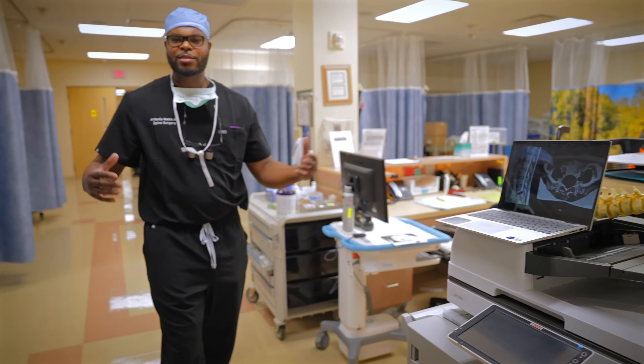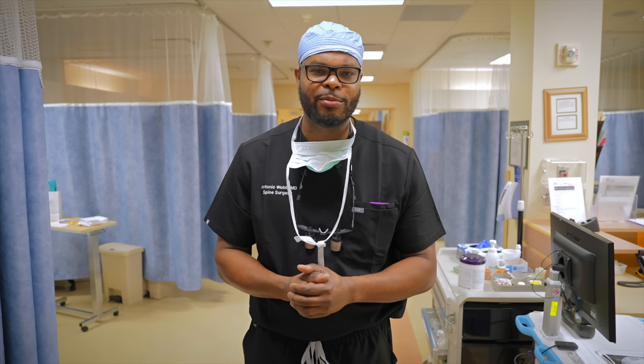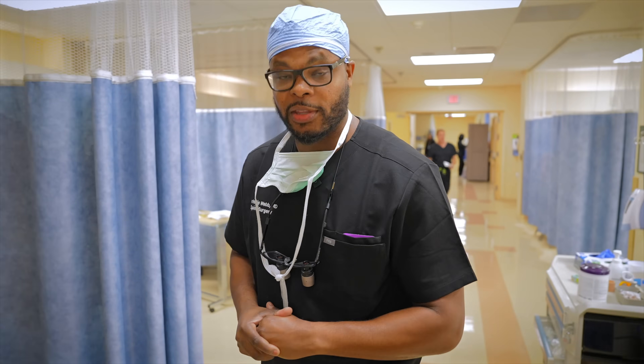This is a relatively quick procedure — it takes 45 minutes to an hour. We use a vascular surgeon for the approach, and most patients go home within 23 hours. We're going to get started here soon and you guys are going to hang out with me today.